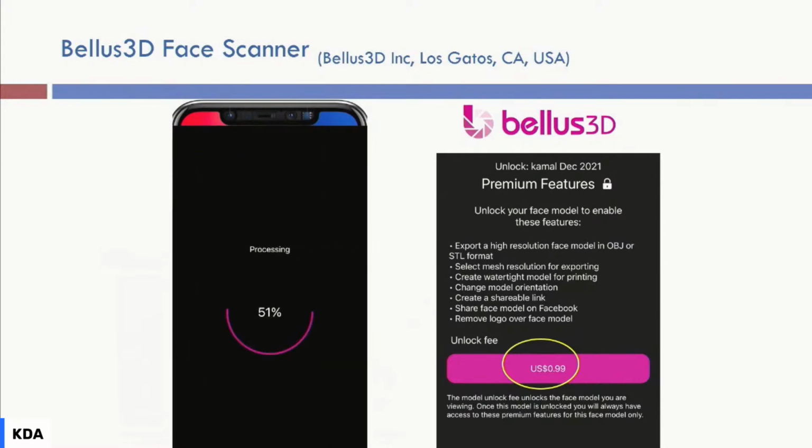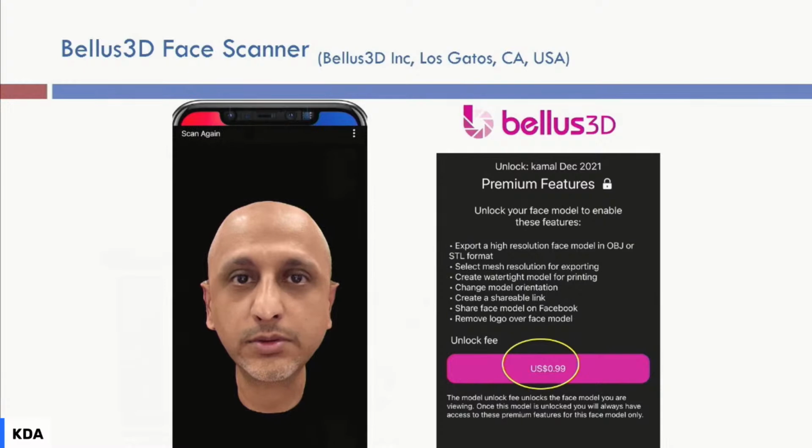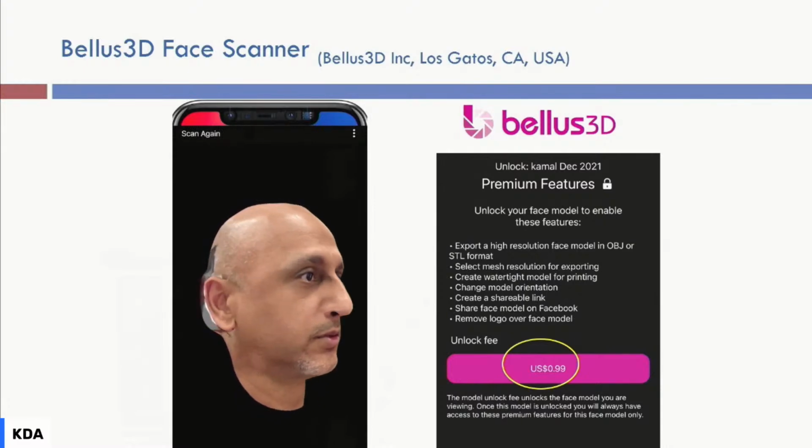It's done in the clinic. It's processed simultaneously, and based on that, you have a 3D image that you can enlarge into, utilize as a 3D reconstructed image, and use in the treatment planning, either to superimpose it on cone beam CT images, because the cone beam CT has the external soft tissue, but without colors.